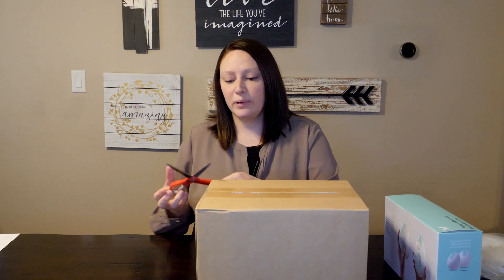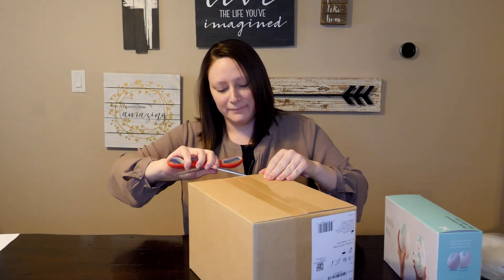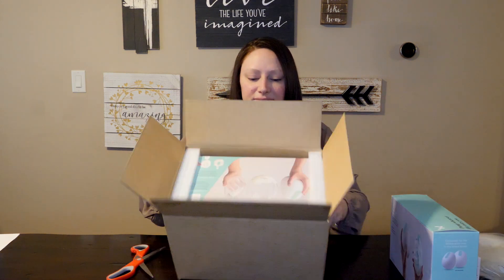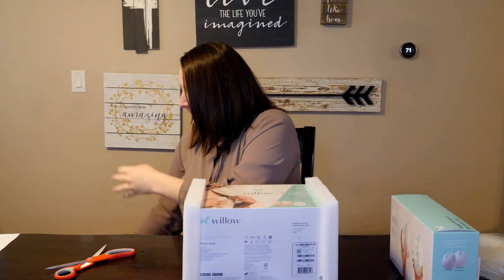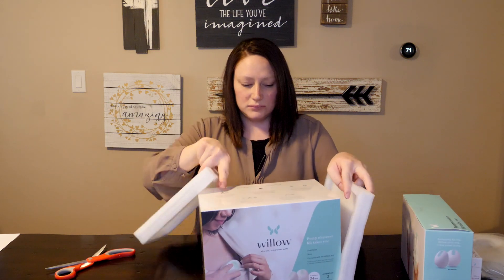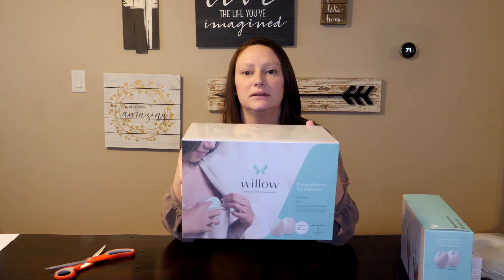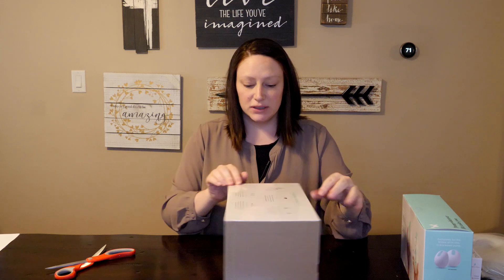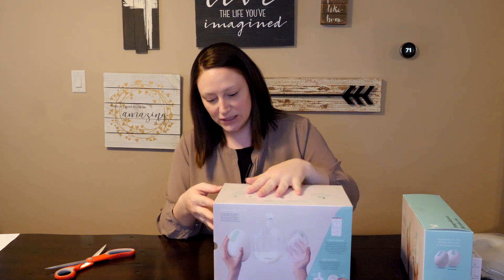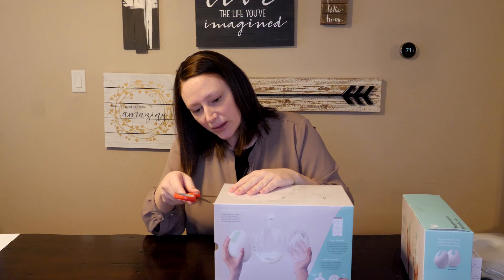Let's go ahead and open this box here. This is what the box looks like — it's covered in plastic, so it's sealed, which is good. That's very sanitary. I'll go ahead and cut into this plastic wrap.